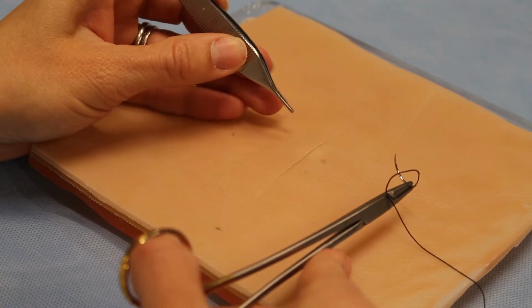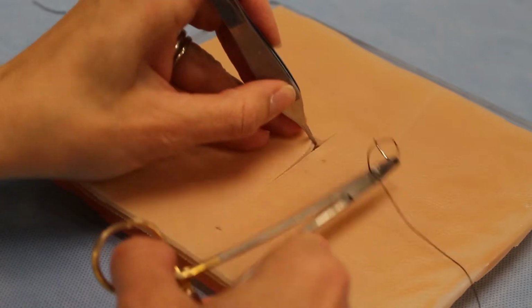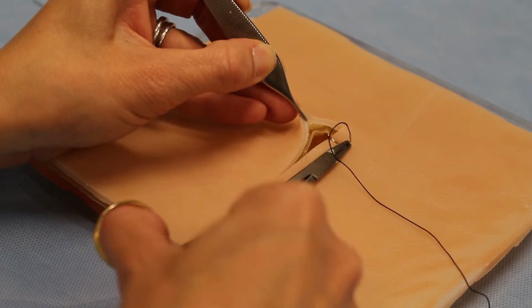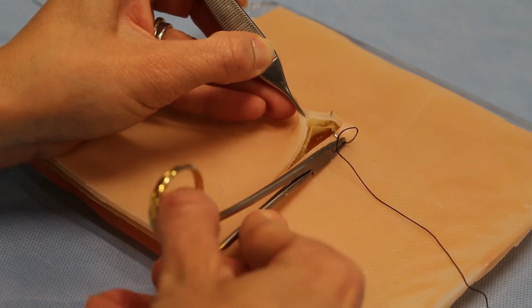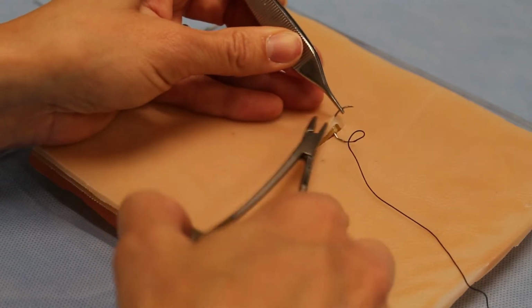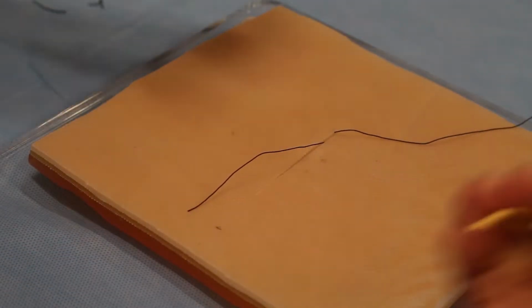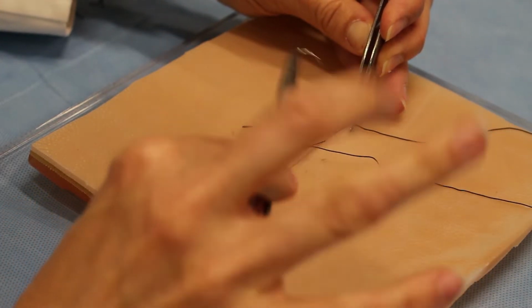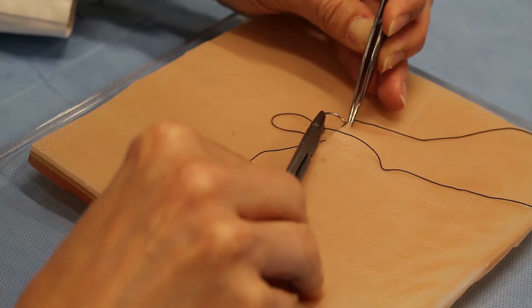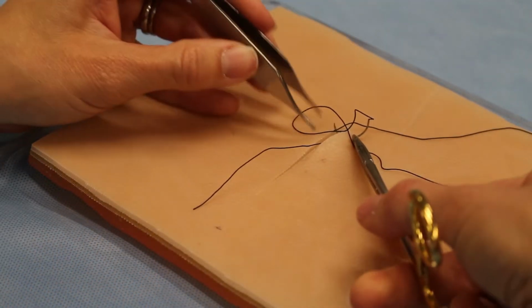I'm going to demonstrate a running subcuticular stitch. There's different ways to throw the knots, but I like to start with a buried knot close to the skin edge, which is where you start deep. You come out right below the epidermis. To change the way I hold the instrument for here, go back in just below the epidermis, back to deep.